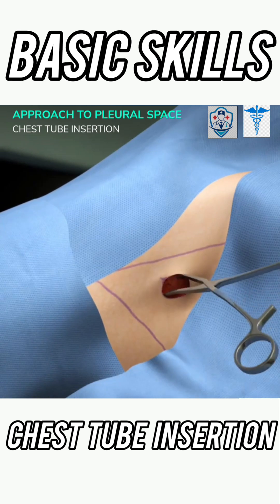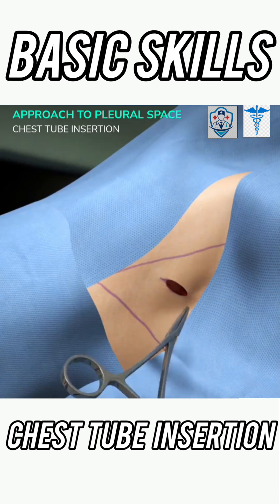Now use the Kelly clamp to blunt dissect down to the intercostal muscles while staying above the 5th rib. This will create a diagonal path.